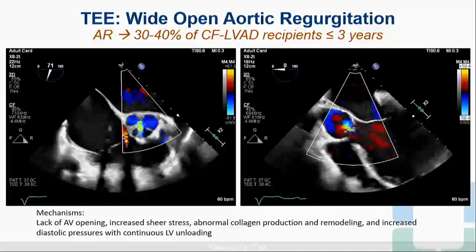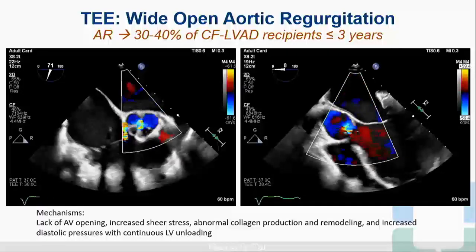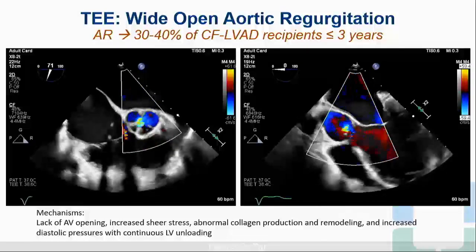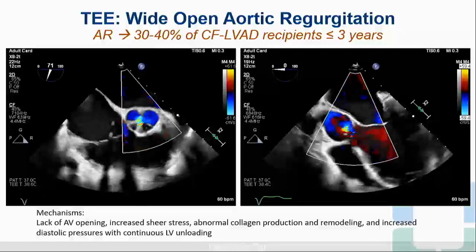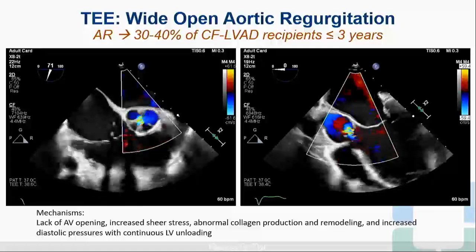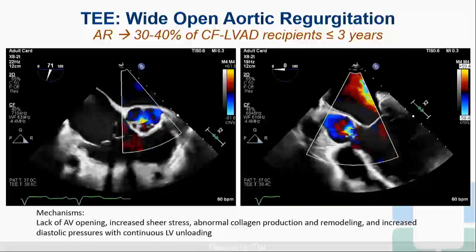Okay. Go ahead, Ferenc. So again, excellent discussion. So our options here could be a surgical approach by closing the aortic valve itself, but this carries the risk that if there is any issue with the outflow cannula, the patient will drop dead. And the other option would be doing a surgical aortic valve replacement versus a percutaneous approach, which could be either a septal occluder device or a TAVR.